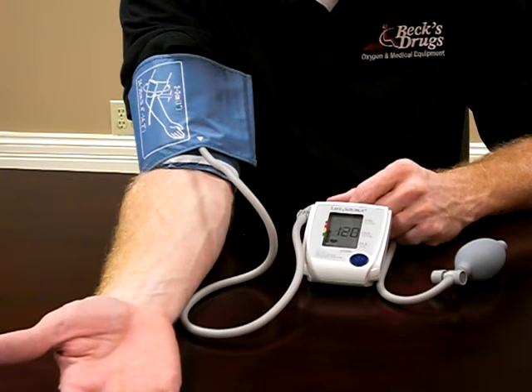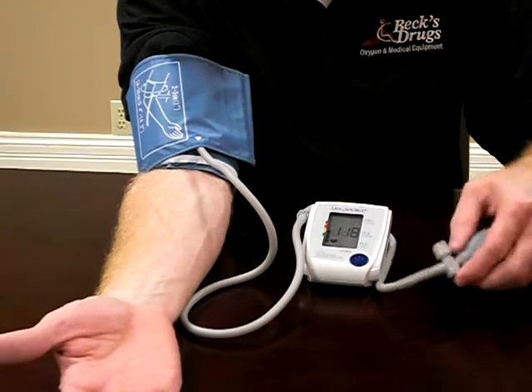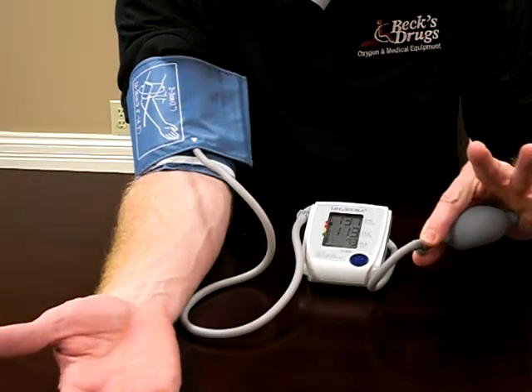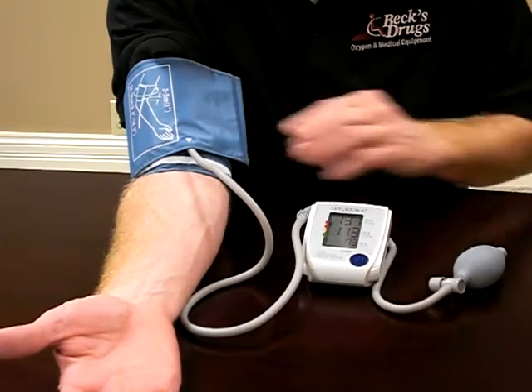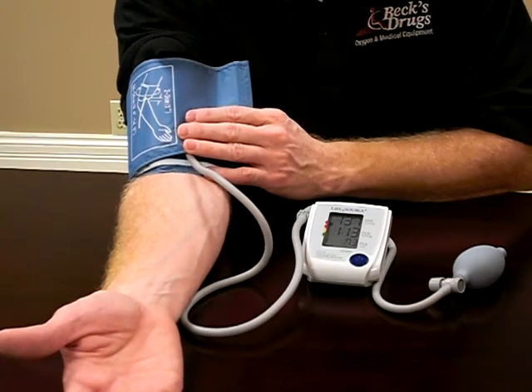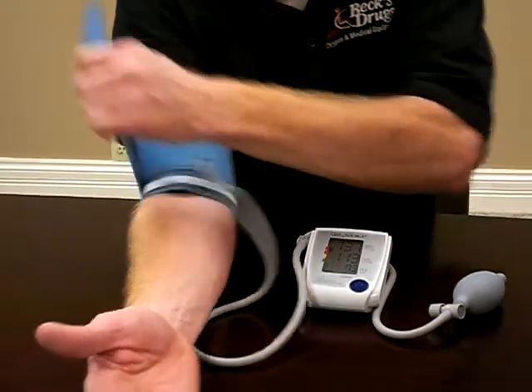Once it reads out correctly, you can deflate out of your bulb. Then take your cuff off. On an automatic unit, you don't have to deflate it — it does it by itself. Then take your cuff off.